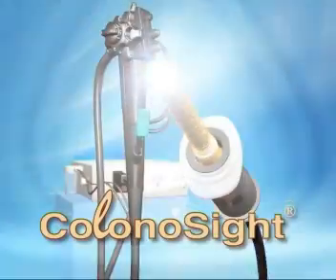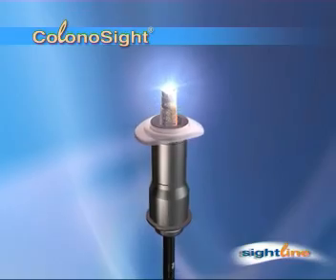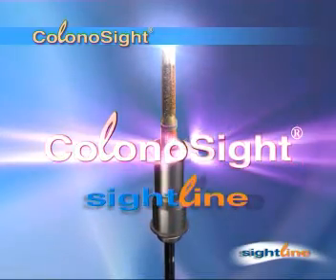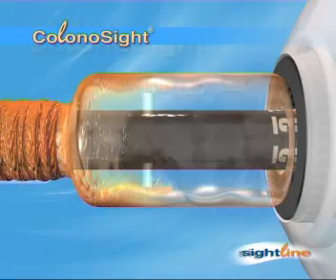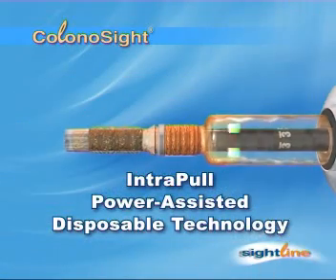Sightline introduces Colonosight, a breakthrough in the field of colonoscopy. Colonosight is a non-fiber optic scope with a unique patented air-pressured front-wheel drive called IntraPull Power Assisted Disposable Technology.